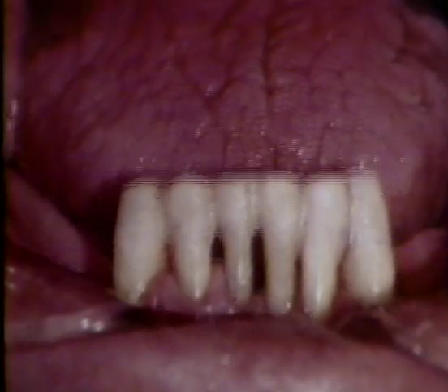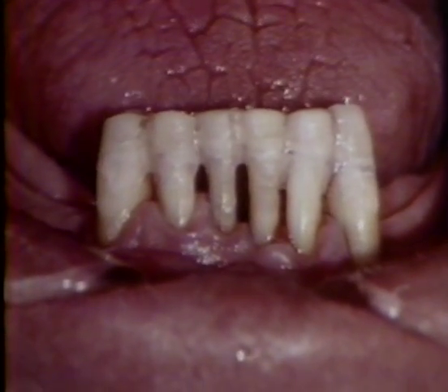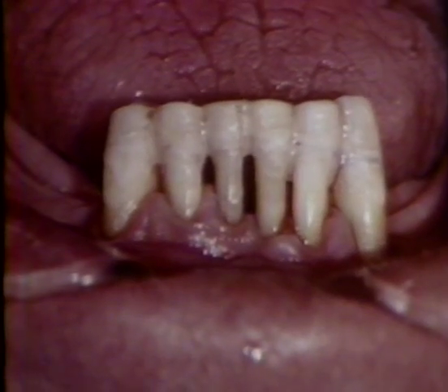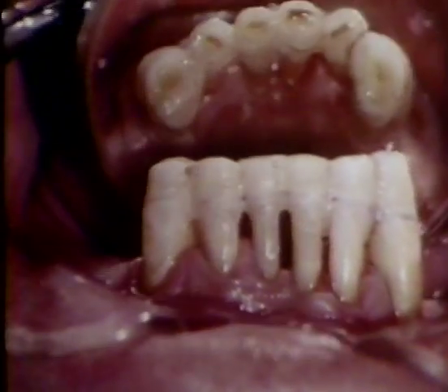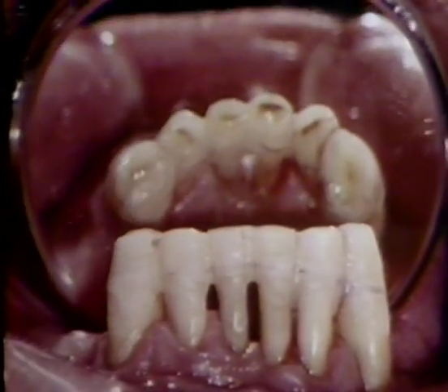These teeth are now able to serve as temporary abutments for a transitional or temporary removable prosthesis. In the meantime, the patient is made more comfortable when chewing. This type of temporary stabilization should not be utilized unless a definite restorative commitment has been received from the patient.